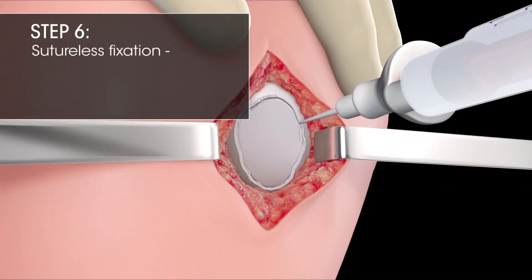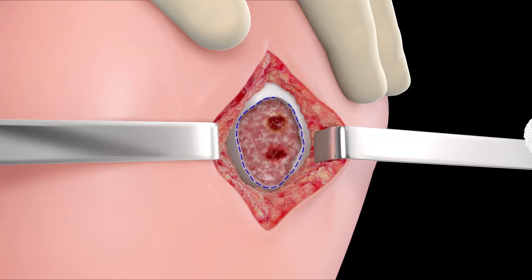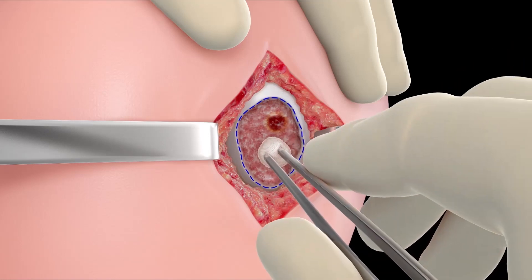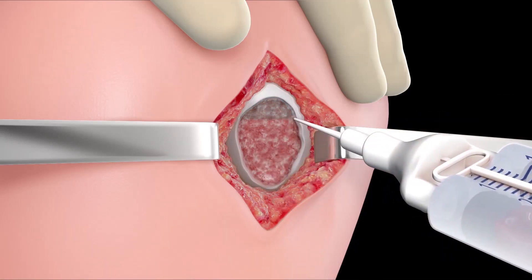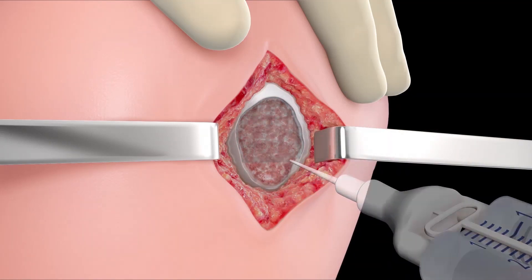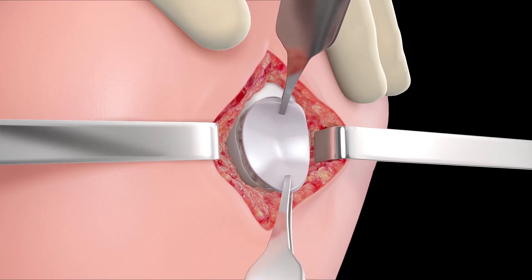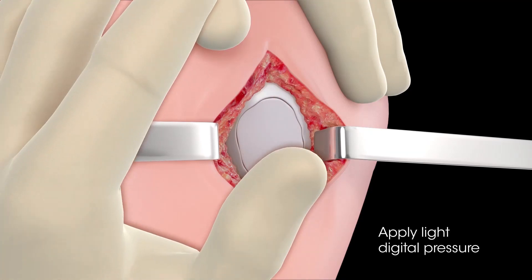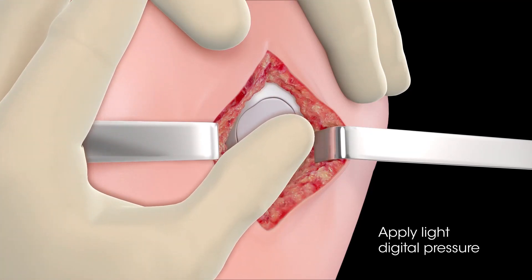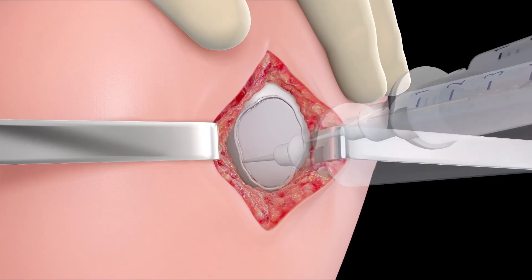Step 6: Sutureless Fixation — Implanting and affixing the MACI Implant solely with fibrin glue. Before applying fibrin glue, check the size and shape of the prepared MACI Implant to ensure proper fit. Ensure the defect base is free of tissue and bleeding. Then apply a thin layer of fibrin sealant to the entire base of the defect. Maintaining appropriate rotational orientation, apply the implant to the defect bone bed with the cell-side down adjacent to the bone. Apply light digital pressure to the implant for approximately 3 minutes.